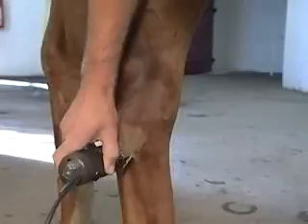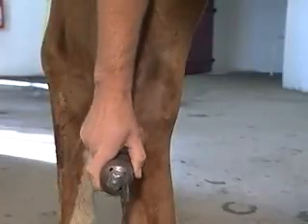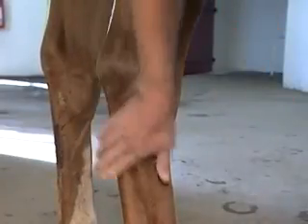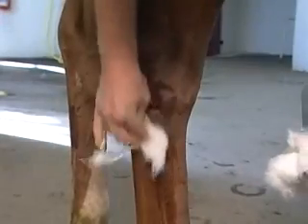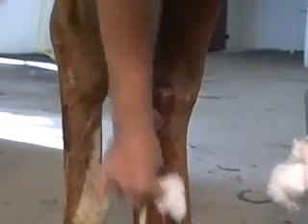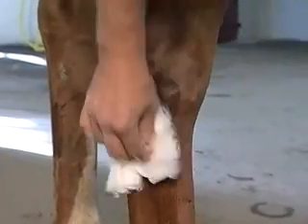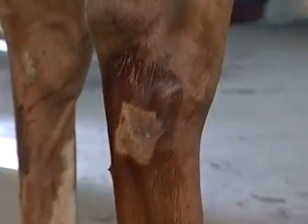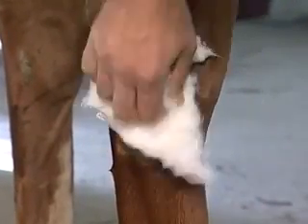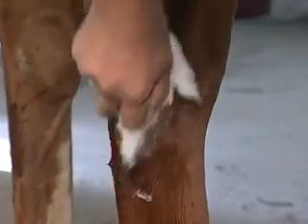The hair is clipped on an area large enough to allow for some movement of the skin should the horse change position after clipping. The skin is washed several times carefully with a skin disinfectant to obtain a sterile surface. Repeat rubbing with new swabs of cotton soaked in disinfectant until they remain white.